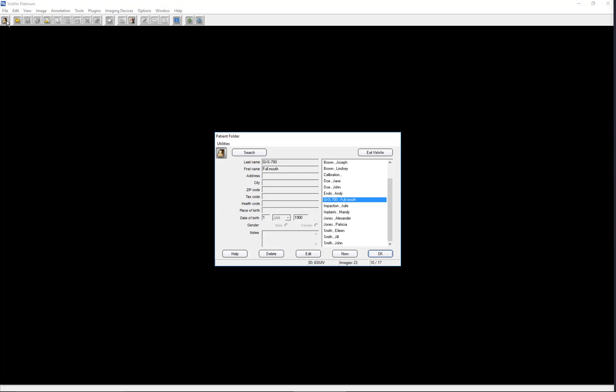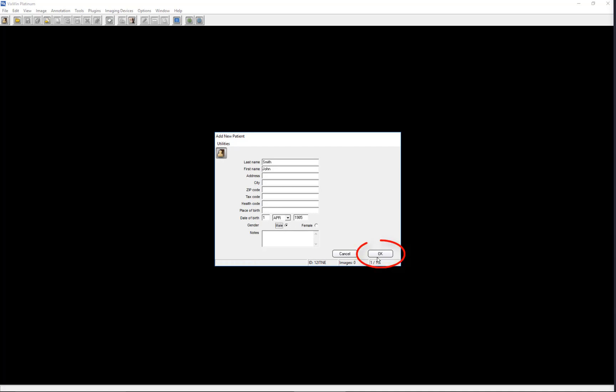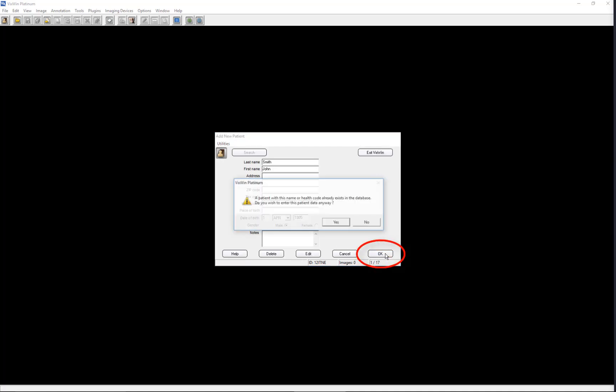Let's begin by creating a new patient record. After clicking on New, enter the new patient name and any other pertinent patient information. Click OK to create the new patient record.